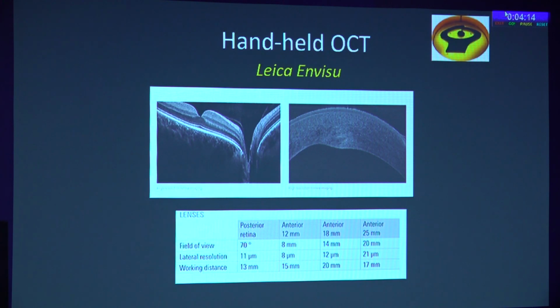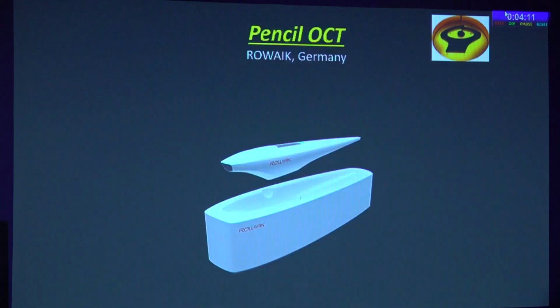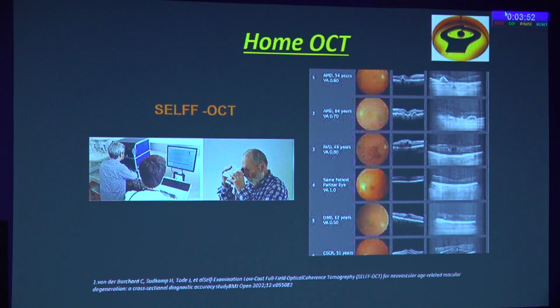This is the macula scan and the ASOCT. And this might be available in a year or so, which is supposed to be the tiniest OCT, called the pencil OCT, that is being developed by Rowiak, Germany, still awaiting approval. It has a scanning system and a docking system, and it's supposed to be in the form of a pocket carrying machine.